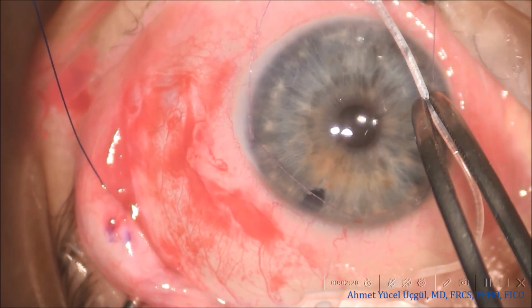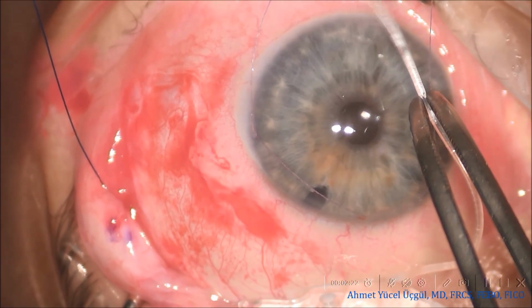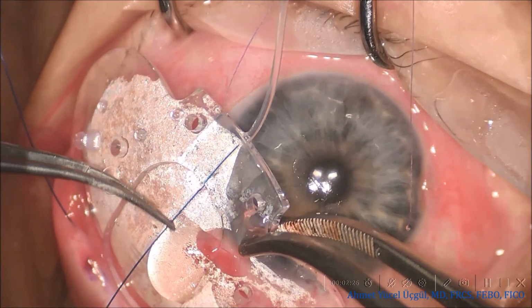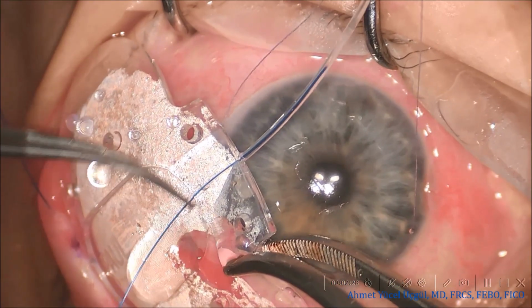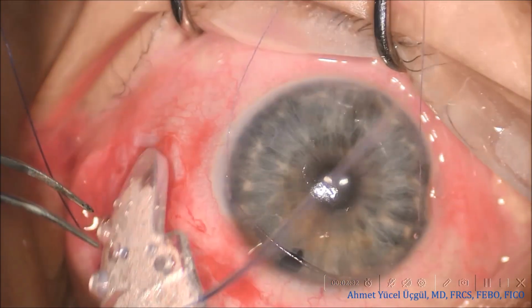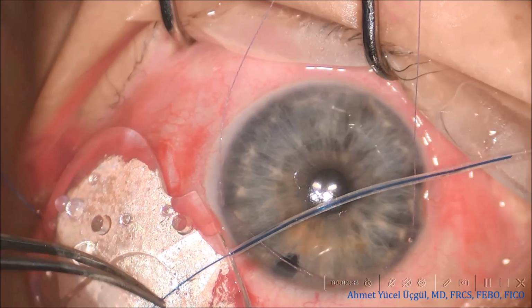After priming the tube, I advance a 6-0 Prolene ripcord suture along the full length of the lumen. This is a critical step for protection against early postoperative hypotony. Based on my personal experience, leaving the ripcord throughout the entire lumen provides the most reliable and consistent early flow control.